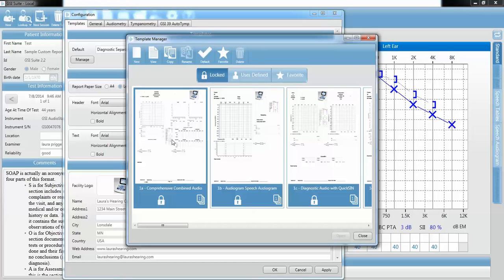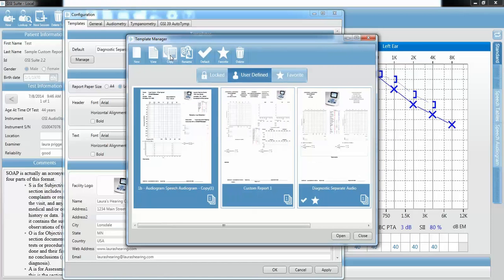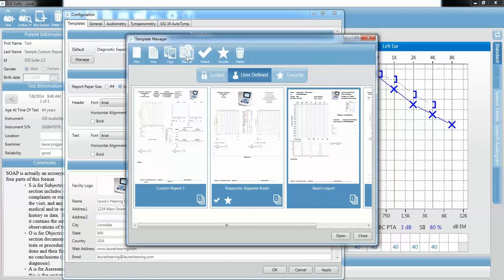You select a report and press the Copy button. I'm going to press Copy, and that is going to place a copy of this report into the User Defined section. From that point, you can rename your report that you've just copied — so I'm going to call it Laura's Report and press Enter. It will then be placed into your User Defined section, and you can double-click on that and modify it from there.